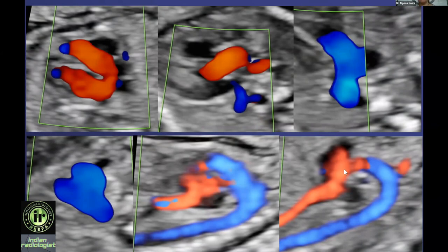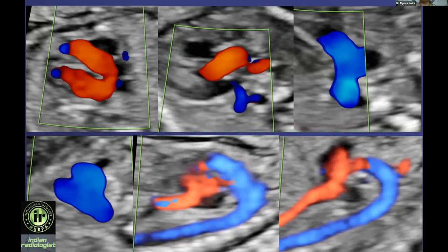So the two inflows, the LVOT, the RVOT, the three vessel trachea view, and the arch views — in the aortic arch view most of the time you can see the IVC coming into the right atrium. We have the habit of taking one 2D image and simultaneously showing one color image in all our routine anomaly scans at 18 to 20 weeks, and it has helped us a lot.